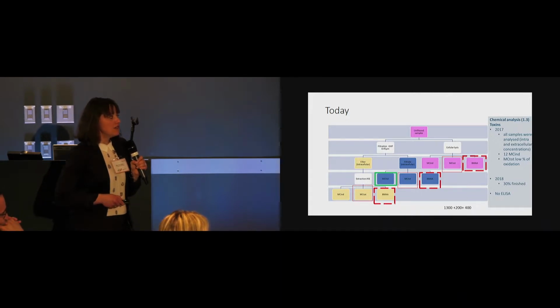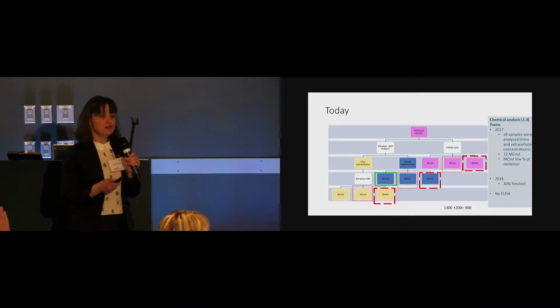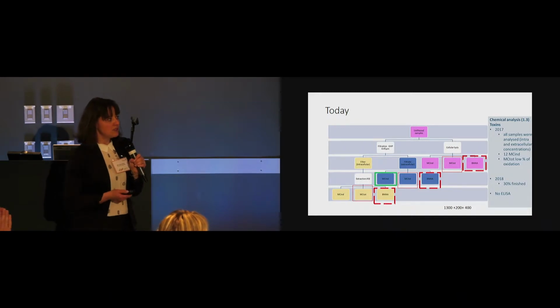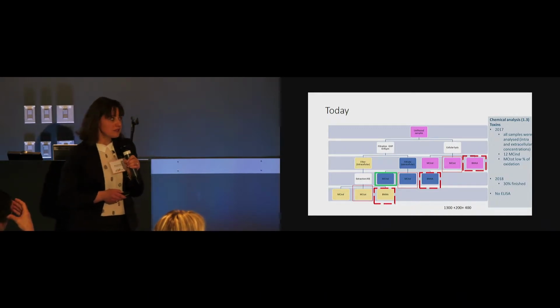And we also have this method, MC total, which they set up, and they start already doing the analysis. One thing I forgot to mention is that when Tuk entered in position, and after they changed the method, he redid all the analysis of 2018. So the 2018 is done with a method which is more sensitive. So now I estimate about maybe 2 months to finish all the analysis.